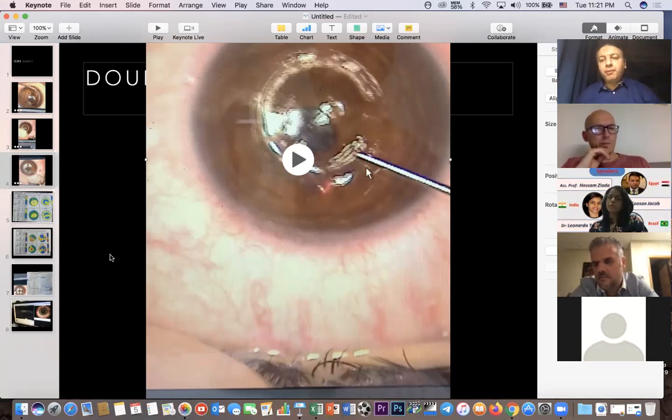Okay, well, about the nomogram, do you follow the nomogram in terms of visual acuity? If there is a patient with best corrected visual acuity less than 6/60, would you go for intracorneal ring segment implantation? Less than 6/60? Yeah, absolutely. I think I would. You would do it. Yes. Okay, but the nomogram states that with vision at or below 6/60, the patient is not a candidate for intracorneal ring segments.